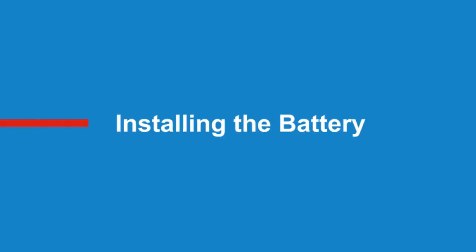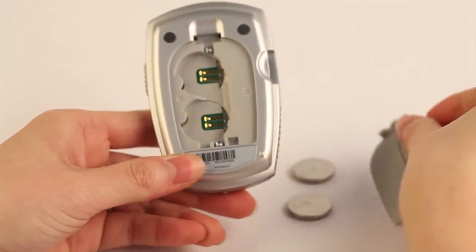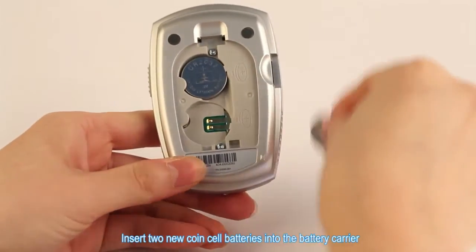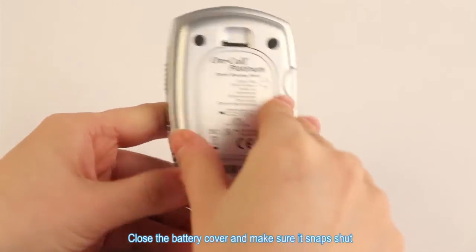Installing the battery. Turn over the meter and press the battery cover tab to open it. Insert two new coin cell batteries into the battery carrier. Make sure they are positioned with the plus side facing up. Close the battery cover and make sure it snaps shut.